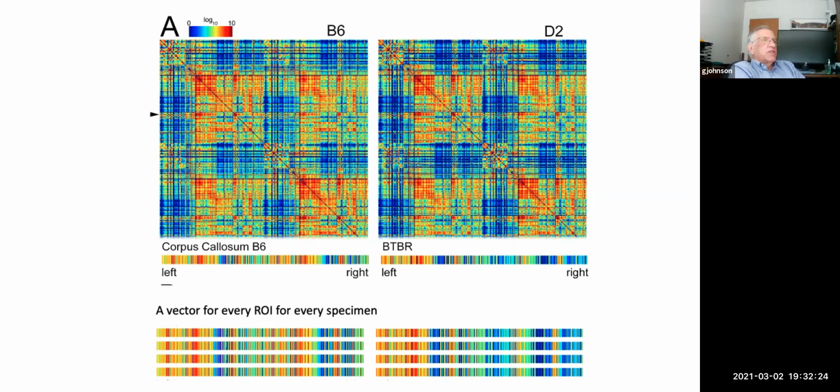And in fact, from a statistics standpoint, it's particularly challenging, because if one looks at a given region and tries to chart how, if you just subtracted these two, it turns out that there are so many comparisons that could be made that the problem of false discovery raises its head. So from a statistical standpoint, it's really quite a nightmare.